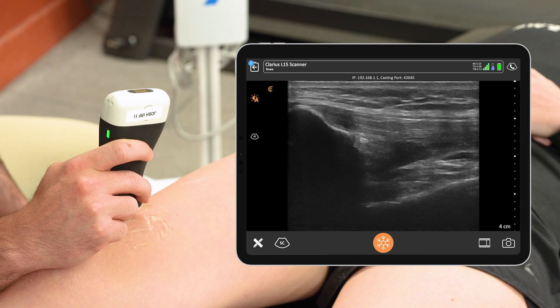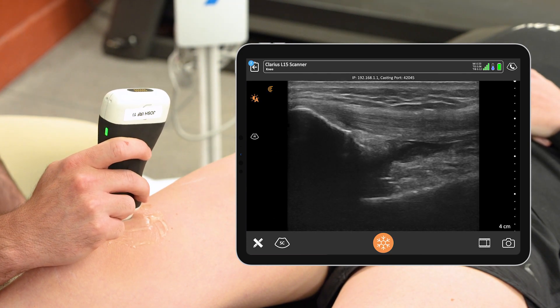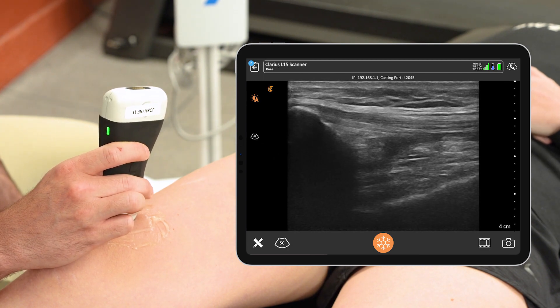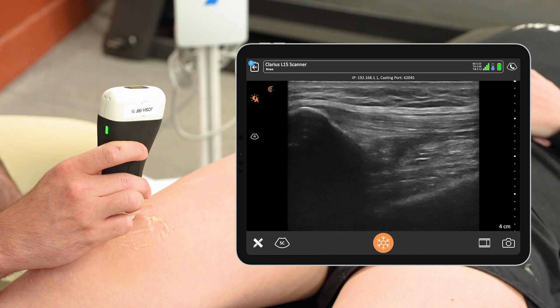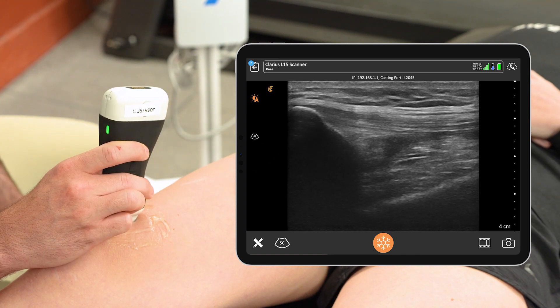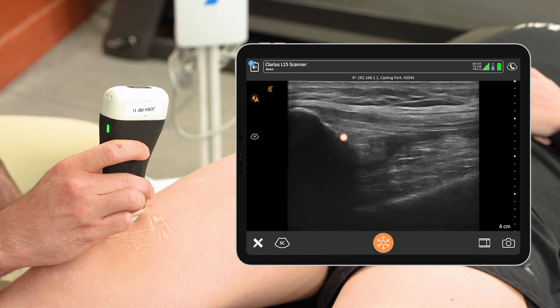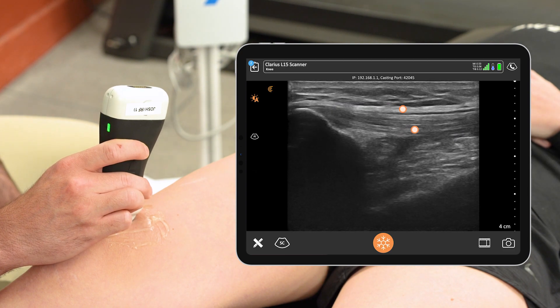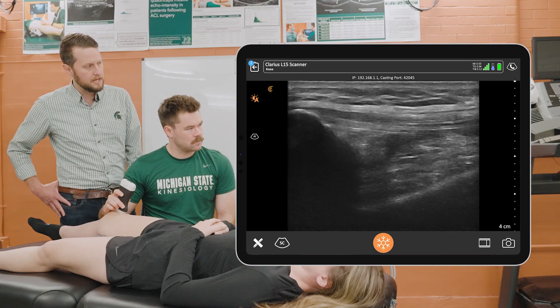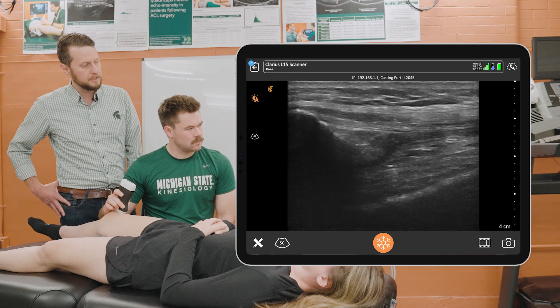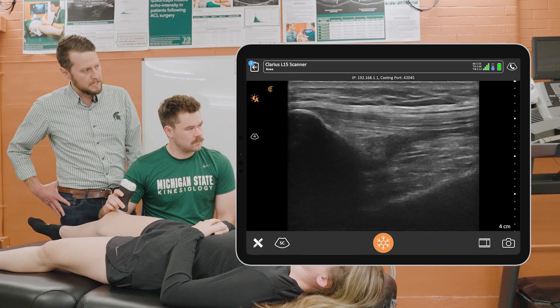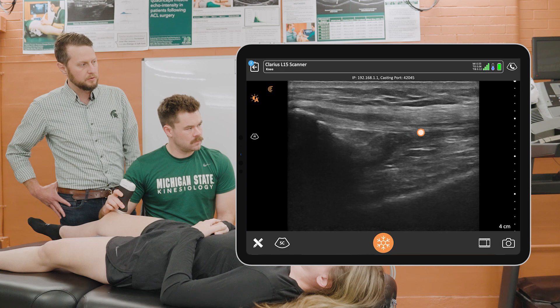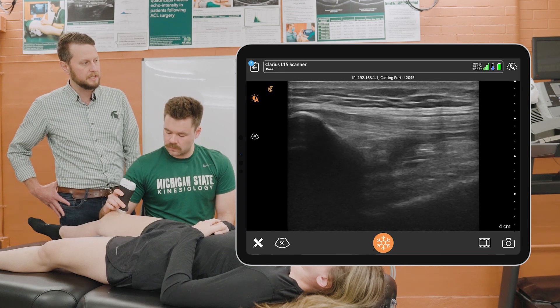As you can see, Cory here has our Clarius probe positioned superior to the patella, above the knee. On the left side of the ultrasound image you can see the dark patella and then the quadriceps tendon running off of the superior pole of the patella and running up superiorly. Under that we have the suprapatellar recess where we have two fat pads, and the black, dark, hypoechoic space in between those two fat pads is the effusion synovitis that we're trying to look at.